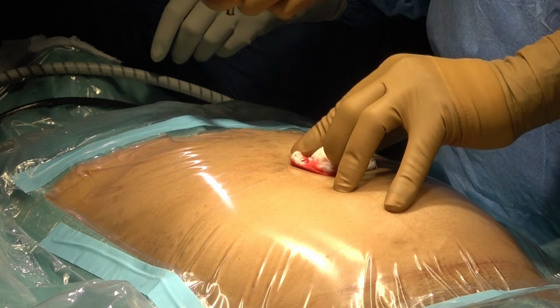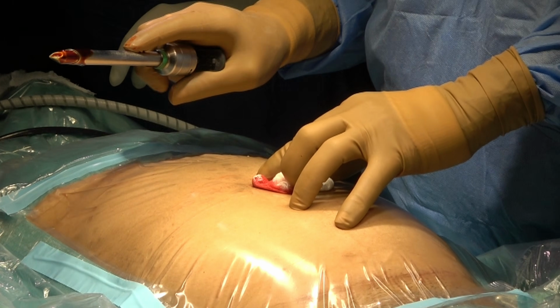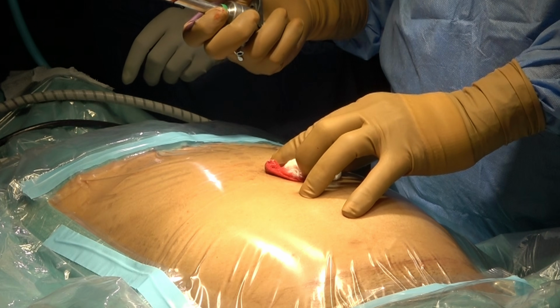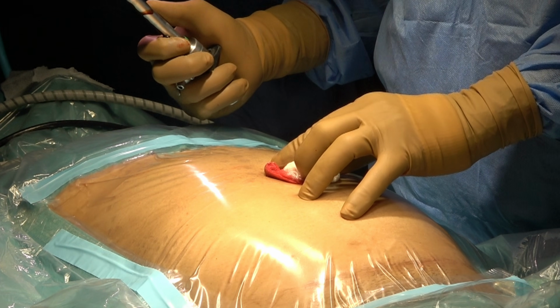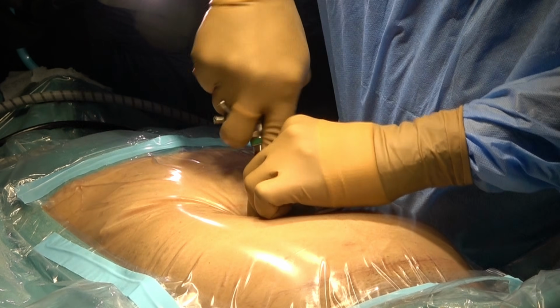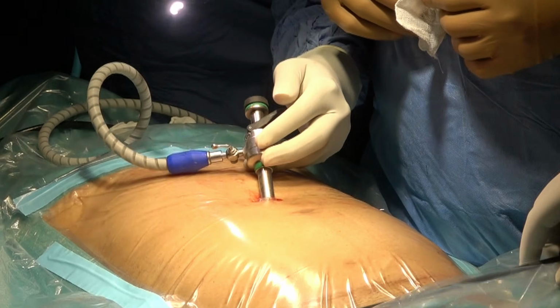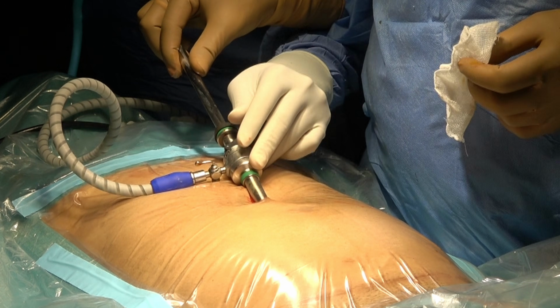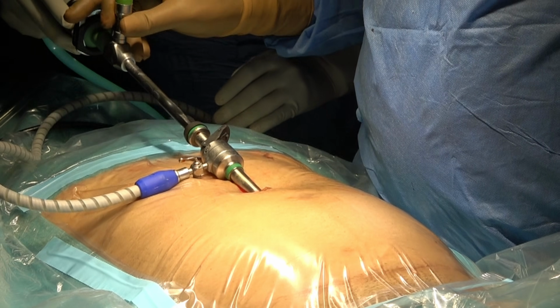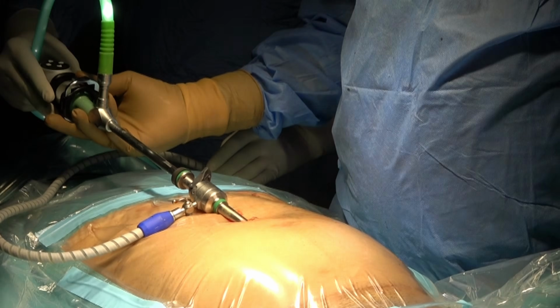So this is the 10 port, and as you know, we hold it like a pistol, and the index finger is pointed towards the sharp end. The thenar eminence should rest over the head of the trocar, with the index finger pointed, and then slowly we enter inside the abdomen. A hissing sound is heard, the telescope is introduced, and then we will put the second port in the right iliac fossa, and then we will start diagnostic laparoscopy.